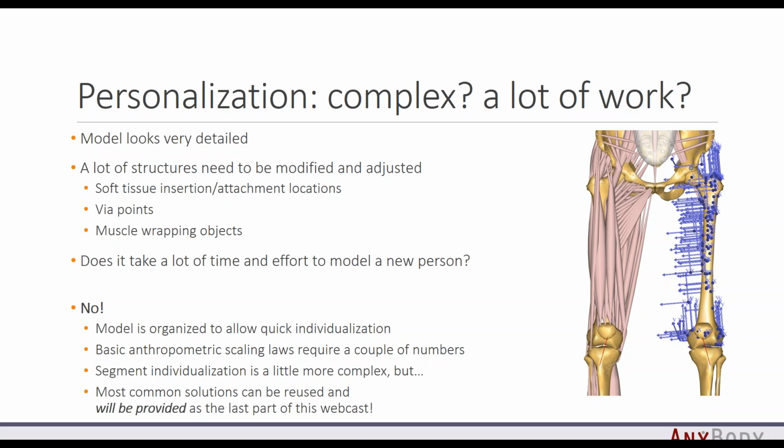But if you look at the body part individualization or segment individualization, it is a little bit more complex, but in reality, we never start from scratch. We always reuse our code. And because of that, the task becomes just to look in the tutorial, copy a piece of code, and just repeat it.